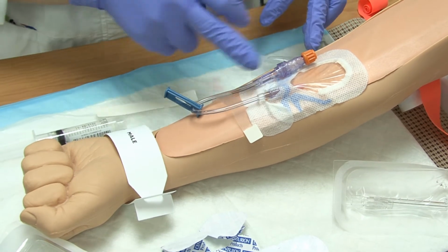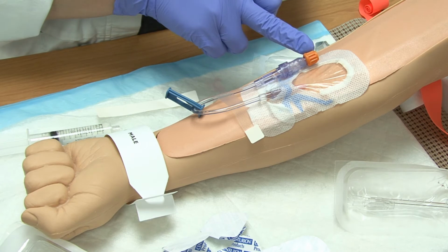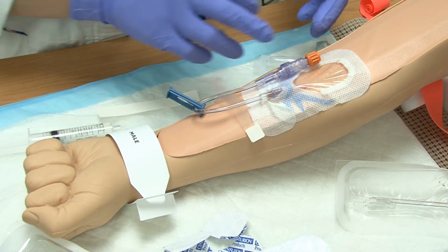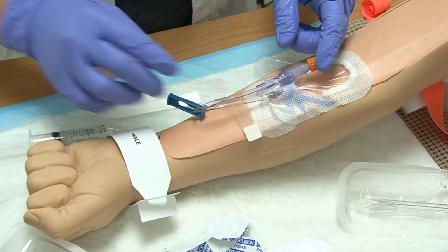Whenever you come back in to use this, then you would need a fresh saline flush, and if you have the swab cap on it, you do not have to swab in between. If the swab cap is not on it, then you must take a fresh alcohol swab and swab before you put the saline flush on.